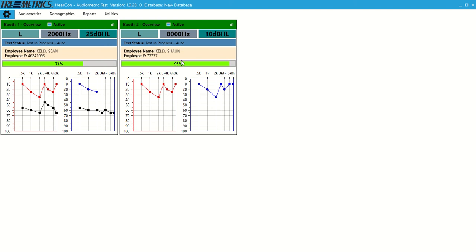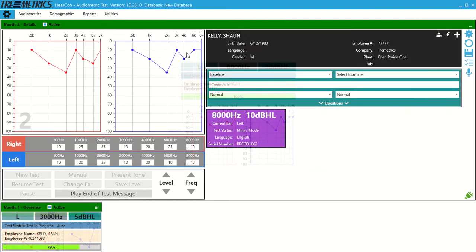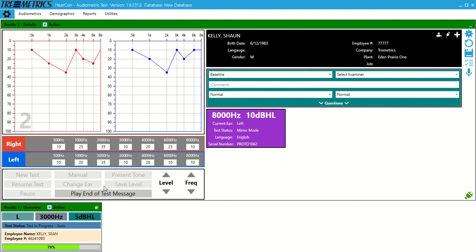This test is about to complete. The reason you see the values you do is the RA 660 can run a demo mode, so we're pretty much simulating a test so we don't have to put anybody in a booth. We can see this test just wrapped up. If we come over here, we have a mimic mode. What this does is until booth one is done, we're just playing dummy tones in the headset of booth two. If you had eight people, you can set it so that it's not going to let anybody out of the booth until everybody's complete.